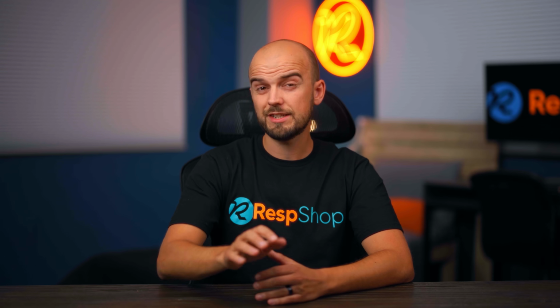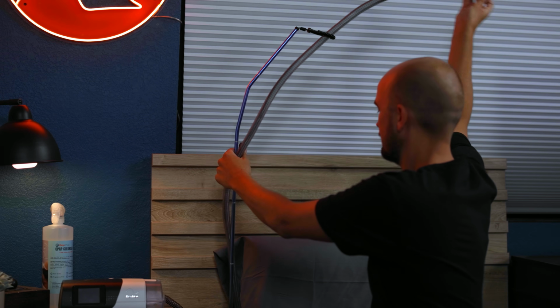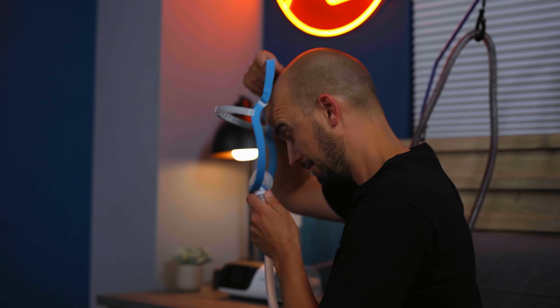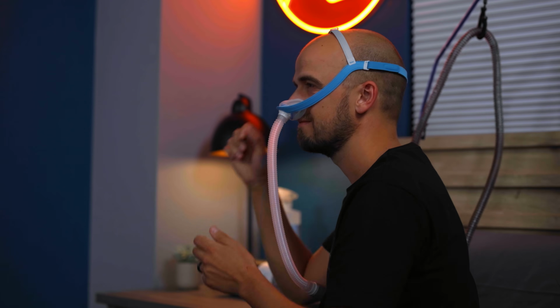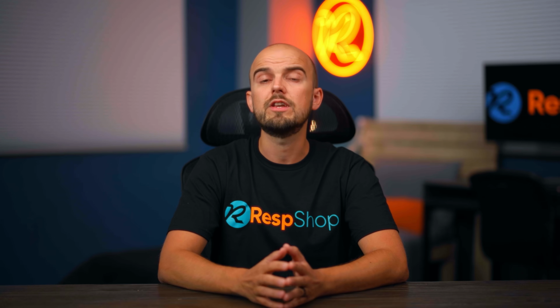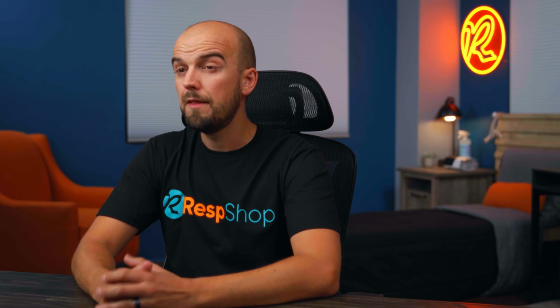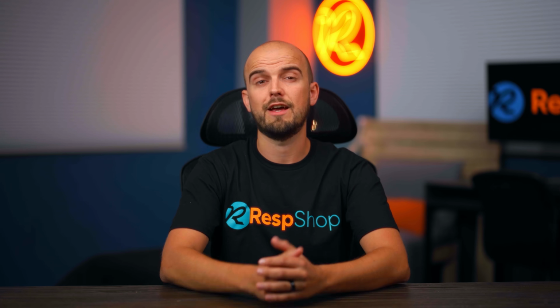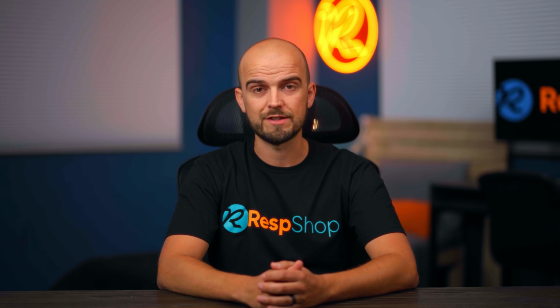If the discomfort for you isn't a problem about getting used to it, you can try alternative kinds of equipment. For example, some masks have tubing that attaches at the head, some at the front. Depending on how you typically move in your sleep and your regular sleep positions, some could be more comfortable than others for you. Then there are other accessories like tube lifts and different tubing diameters and lengths that can change the weight and feel of the equipment. Experiment here for what works for you while you get used to this new equipment.